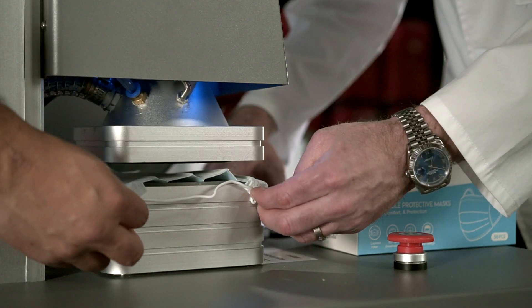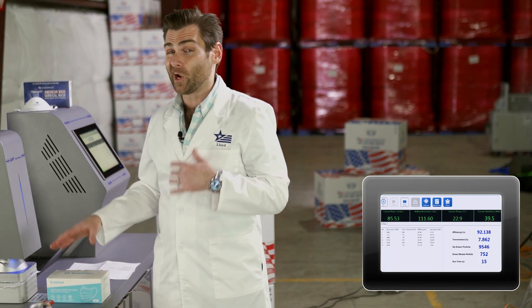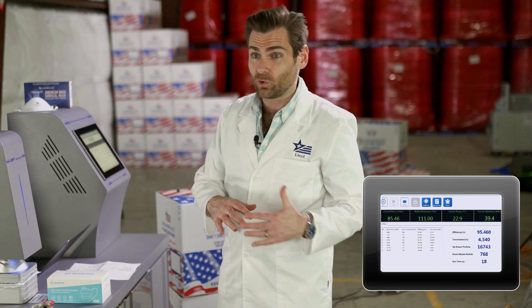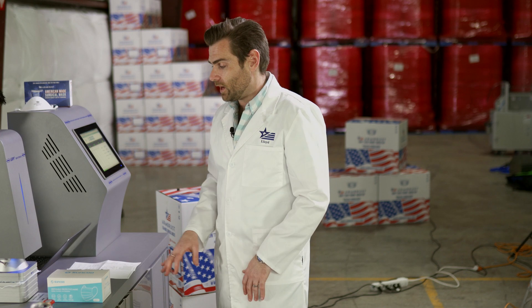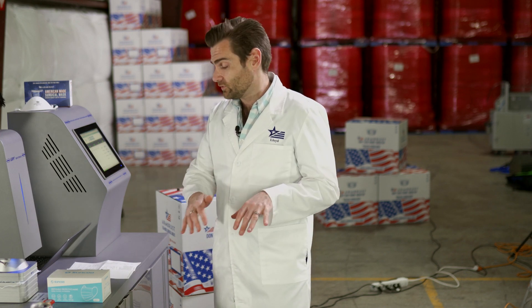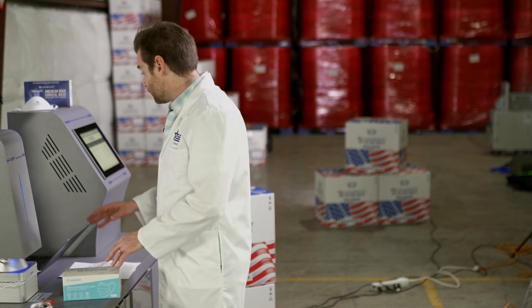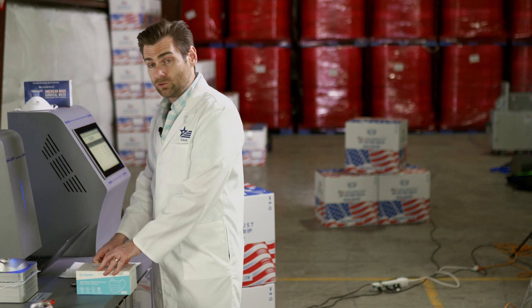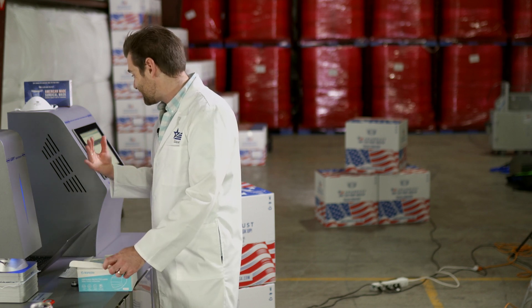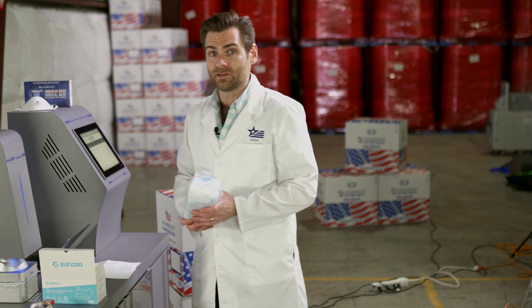This machine is a PFE machine. If you want to find out more about how this machine works — we're not talking about fit or a lot of other things to consider, just filtration — I'll put a link to that video below. What this is testing is filtration efficiency. We're also looking at airflow resistance, which is sitting at about 97 pascals right now, which is pretty good — you want to see that below about 150 pascals.